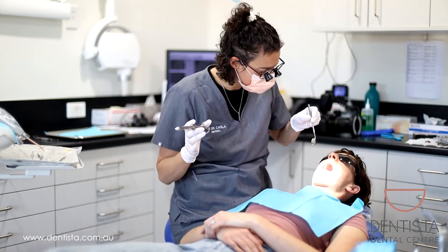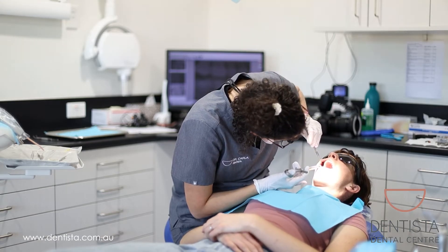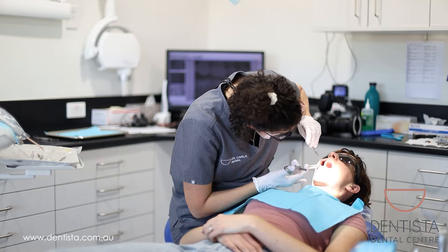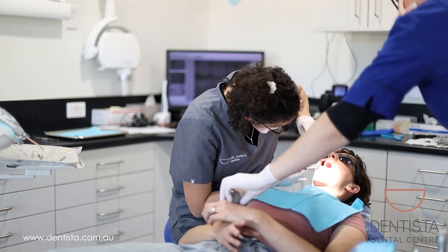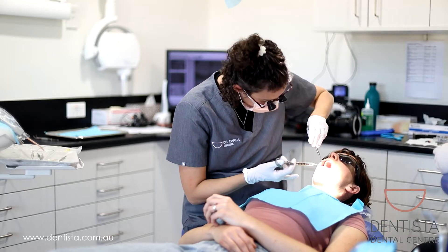Now we're going to numb Erin up. Numbing Erin's tooth means that she won't feel any pain during the procedure. You can still feel a bit of pressure but no pain. It can sting a little bit when it goes in, so we've given Erin a little stress ball.